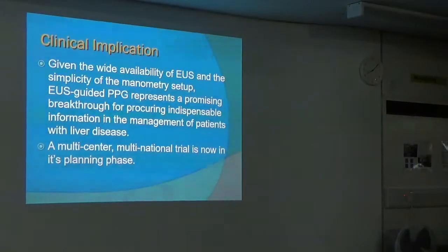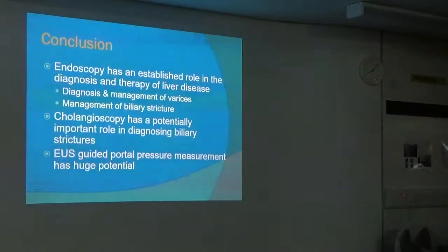So, and again, that's their conclusions I've just said of the potential for this. As a conclusion to my talk overall, hopefully I've persuaded you that endoscopy has a very much established role in the diagnosis and therapy of liver disease. It's a very important means of diagnosing and treating esophageal varices, dealing with biliary strictures, that cholangioscopy, putting the instrument into the bile duct and having a look, has got an important role in centres such as this in diagnosing narrowing strictures. And that last bit I mentioned about measuring the portal pressure potentially has huge potential.